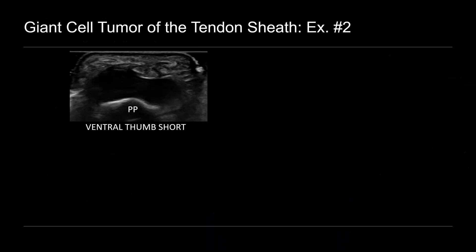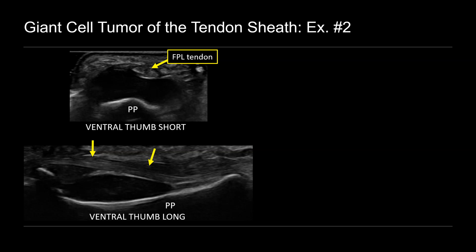Let's look at another example of a giant cell tumor of the tendon sheath. This patient also presented with a ventral thumb mass. This one is a bit more distal, still overlying the proximal phalanx, but notice it's insinuated deep to the flexor pollicis longus tendon. When we turn on long axis, you can see that relationship a bit better. There's the tendon, there's the underlying mass there between the tendon and the proximal phalanx.